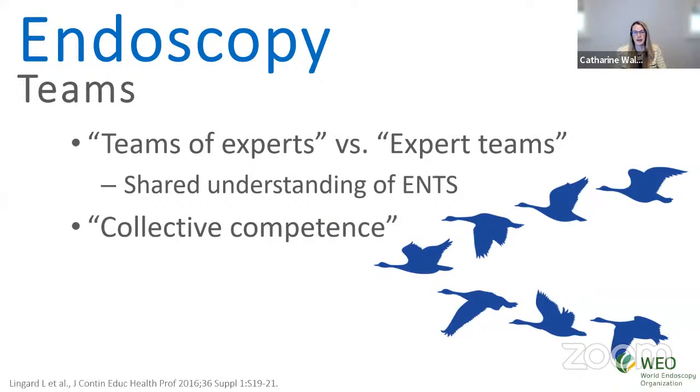And as in many other areas of healthcare, teams in endoscopy are constantly changing. So this results in teams of experts rather than expert teams, because you're constantly working with new people. And this kind of teamwork really relies far more heavily on a positive safety attitude, a shared understanding, and an efficient exchange of information. So therefore, it's really paramount that non-technical skills are developed for both the endoscopists themselves, as well as the broader team members.